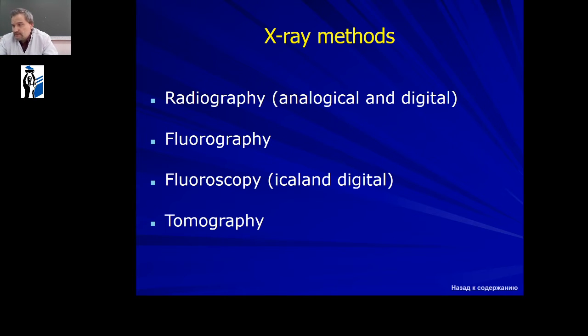On this slide, we have the main X-ray methods. First, radiography, analog and digital, different types. The second is fluorography. Third is fluoroscopy. And fourth is tomography.